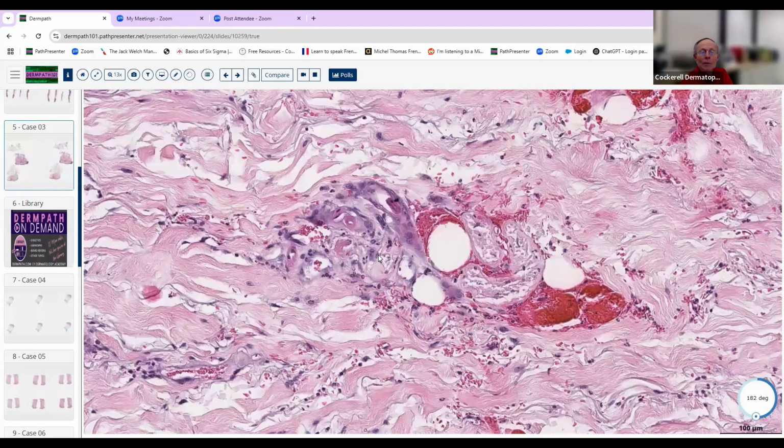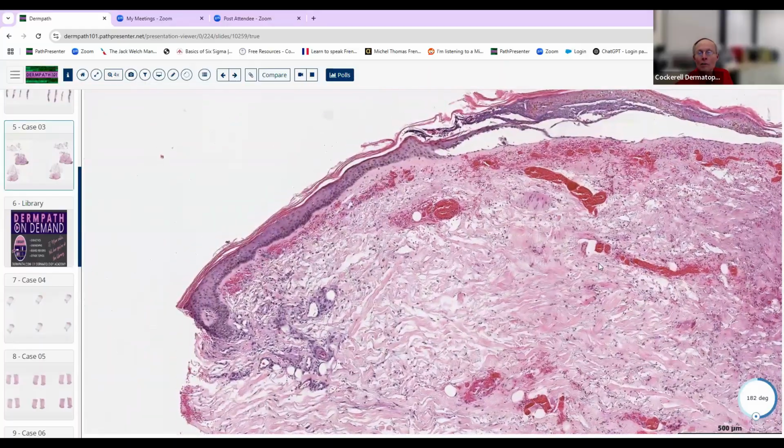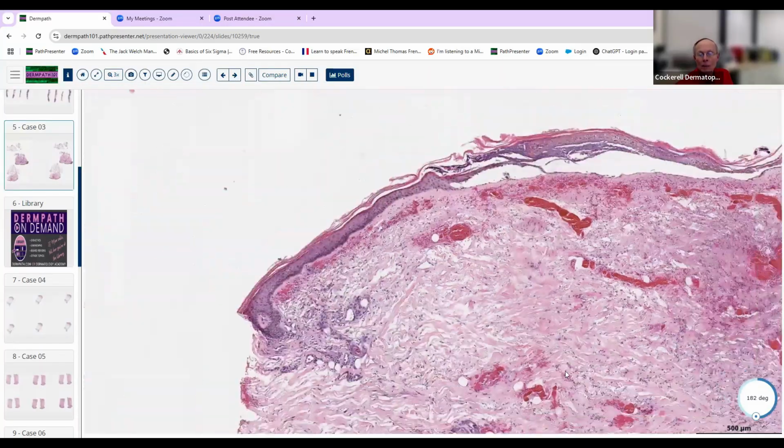As you know, the sweat gland epithelium is a rapidly metabolizing cell. Those cells are undergoing an ATP-driven reabsorption of ions when you make eccrine sweat. And so if they get ischemic at all, they're kind of like your brain cells. They die faster than other cells. So in addition to having the epidermis that's necrotic, you see that there's also necrotic sweat glands. So that's a bad sign.